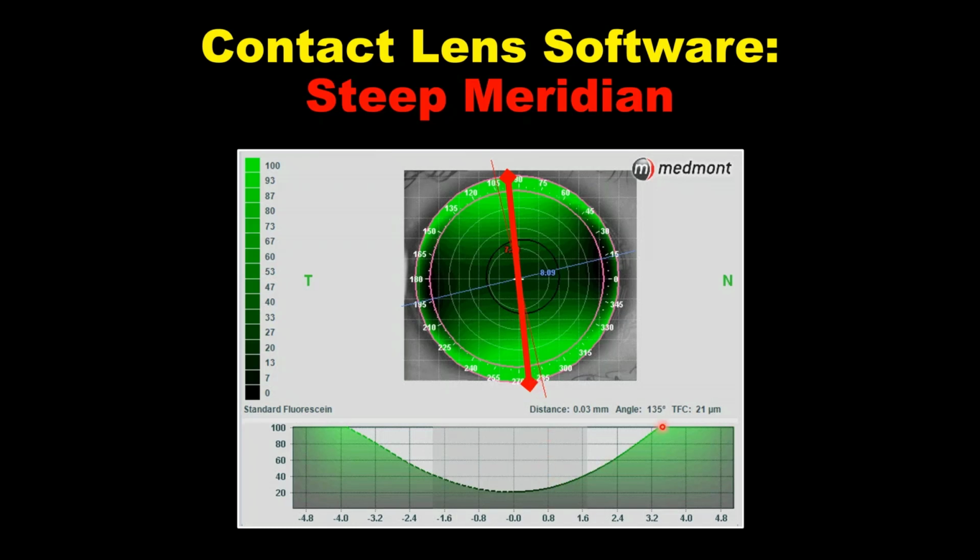Now remember that this cornea was about a 4.5 diopter corneal astigmatism. So for those of you who think in millimeters, that's approximately 0.9 millimeters of corneal astigmatism. We have an incredibly toric eye. So it makes sense that if we were to place a spherical contact lens on an incredibly toric patient, we're going to get a massive amount of fluid underneath 12 and 6 o'clock.